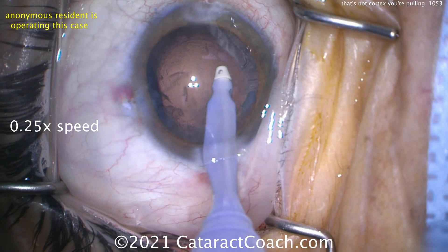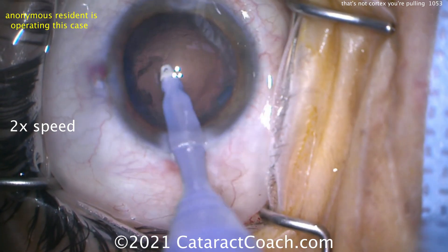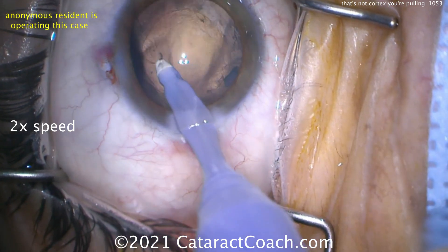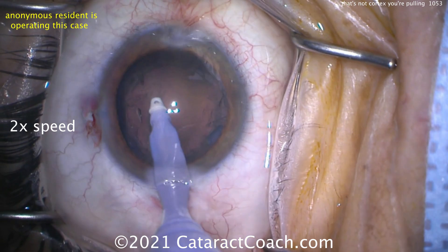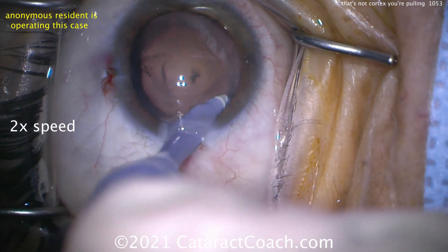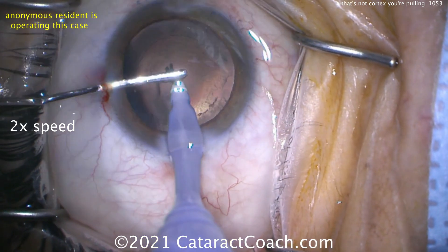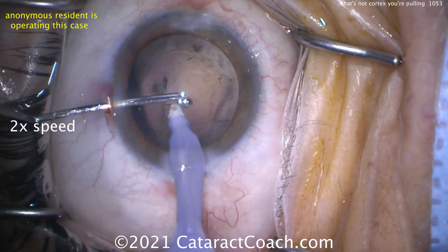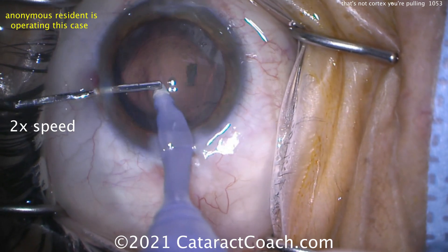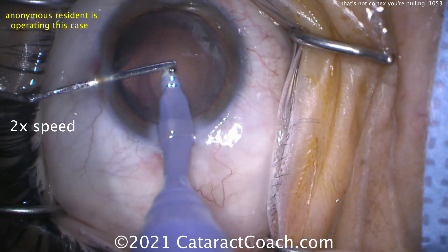Let go of it and be careful not to do that again. You don't want further damage or prolapse of vitreous, so keep the anterior chamber pressurized — that's a very important point. Take out the rest of the cortex carefully and stay away from the area where you have zonular loss. For about two clock hours of zonular loss, do you want to put in a capsule tension ring? If we can put the IOL in the bag with the haptics pushing out toward that area of zonular loss, it'll help bolster and support that part of the capsular bag.